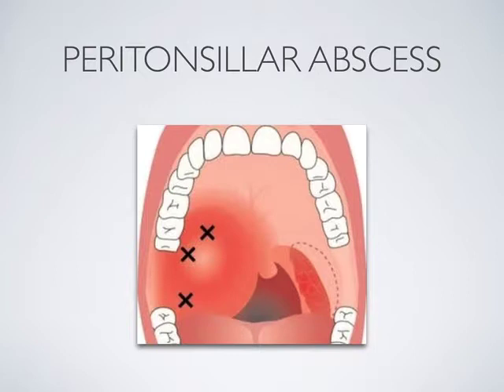Lidocaine is then injected into the mucosa along the superior and lateral border of the tonsil at the intended aspiration and incision site using the 25 gauge or smaller needle and 3 cc syringe. The 18 gauge needle attached to the 10 cc syringe is then obtained.